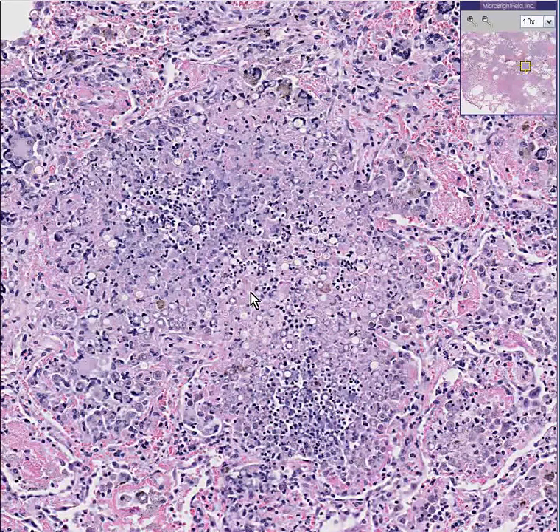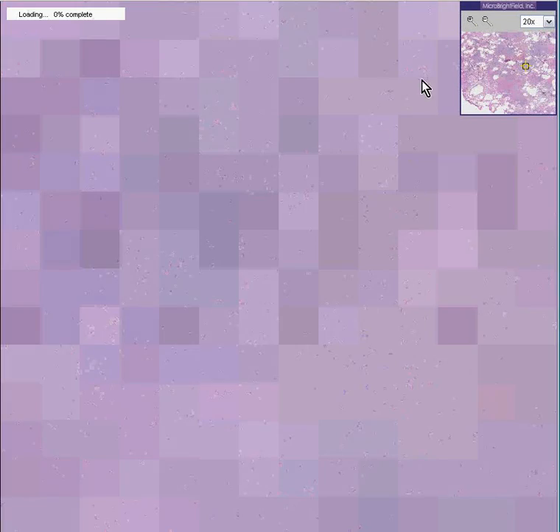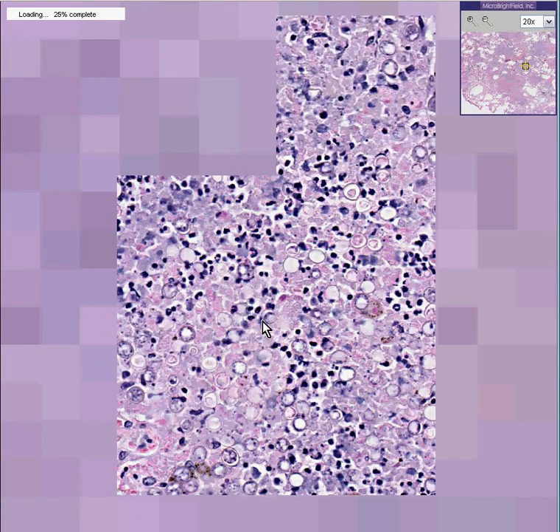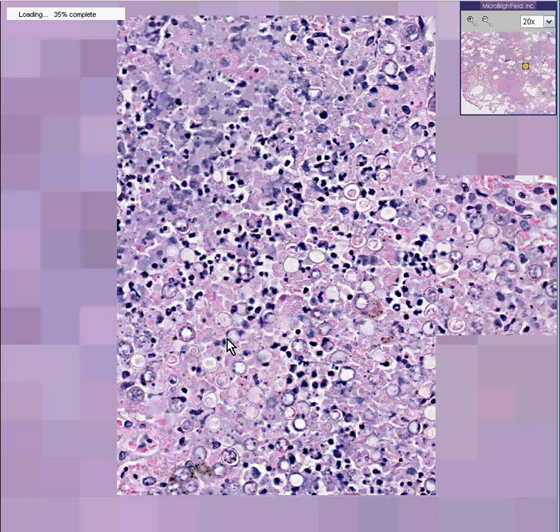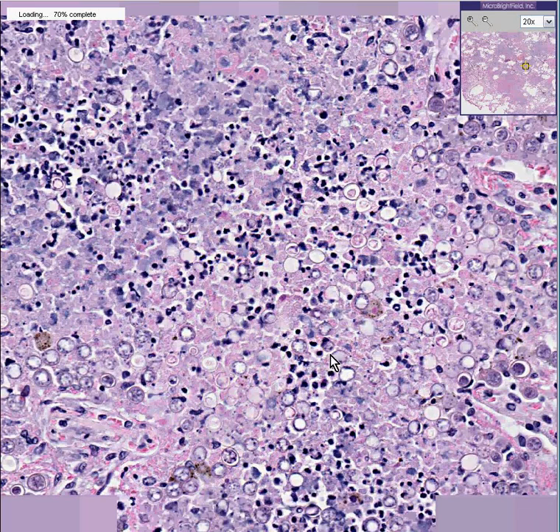This is a classical granuloma, and if you would like to call it centrally necrotic or even caseating, that would be okay too, because it looks like in the central areas the cytoplasm is kind of fuzzy and you can't make out cells too well.